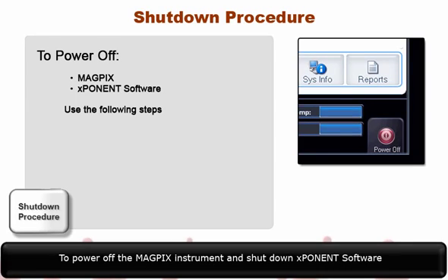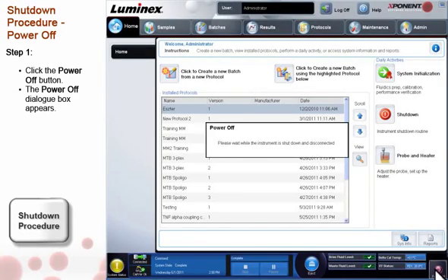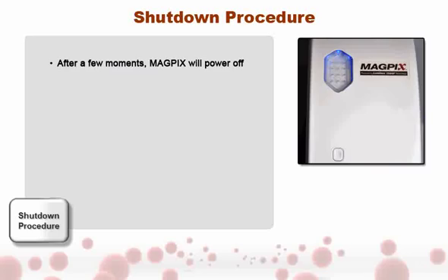To power off the MagPix instrument and shut down Exponent software, first click the Power Off button in the right-hand corner of Exponent. A dialog box appears that says Please Wait while MagPix shuts down and disconnects. After a few moments, MagPix will power off.